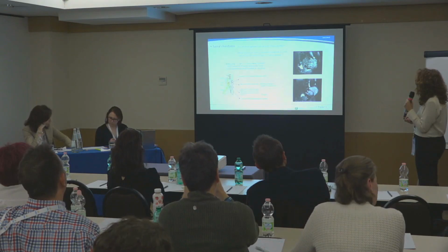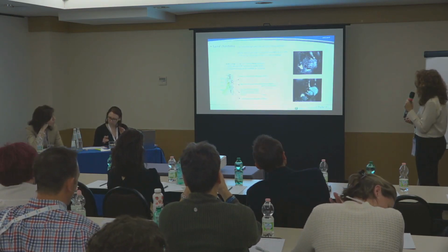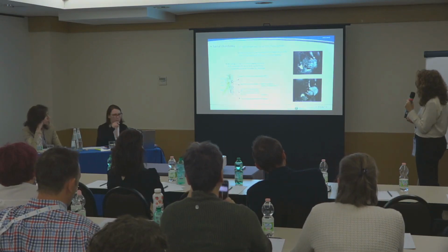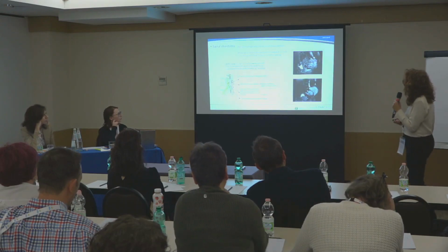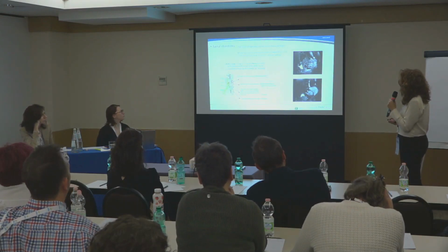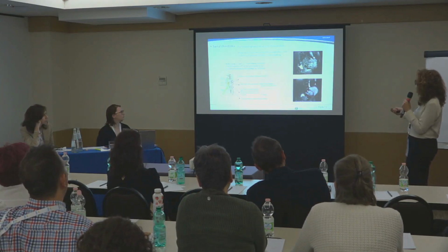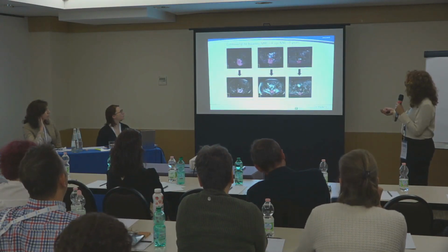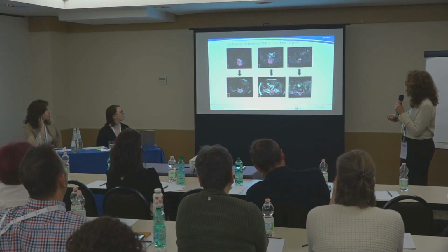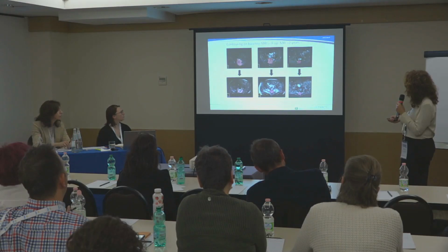because the damage from surgery depends on the level of the extension of the tumor, and in this case we are starting to have a choice for the patient. You see, in this case, when the tumor is from the S2 level, we have the possibility to discuss with the patient, and the patient's preference is to choose carbon ions. So this is an example of good results after 2 years, the big mass and reduced mass.